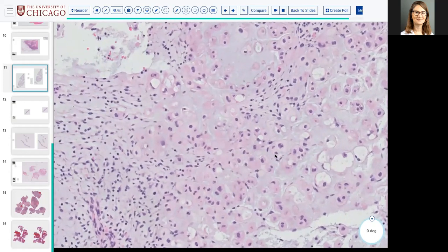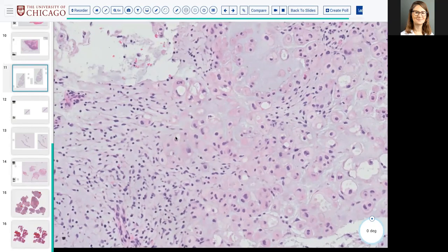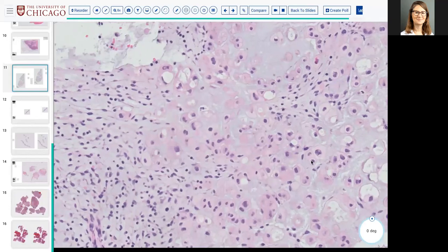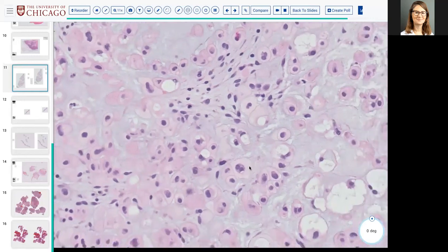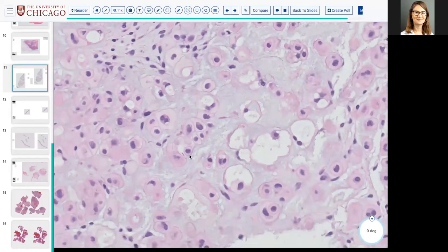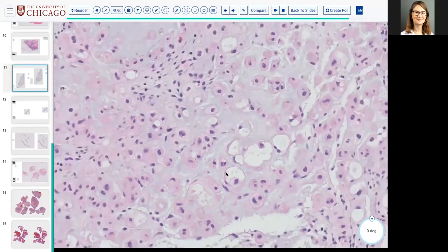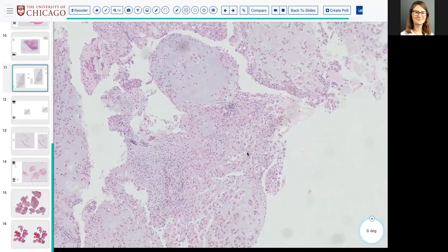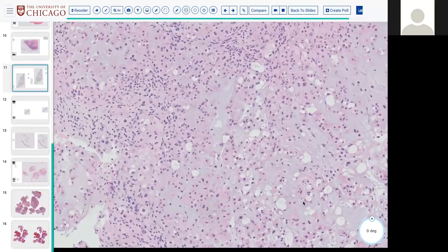But to me, the more striking thing that would push me away from that is, again, the cytoplasm. There's quite a ton of almost glassy cytoplasm in these cells. There's not much pleomorphism, and there is this cytoplasmic vacuolization, and there are not prominent curvilinear blood vessels. One here and there, but not a lot. Would you call these vacuoles bubbly at all?